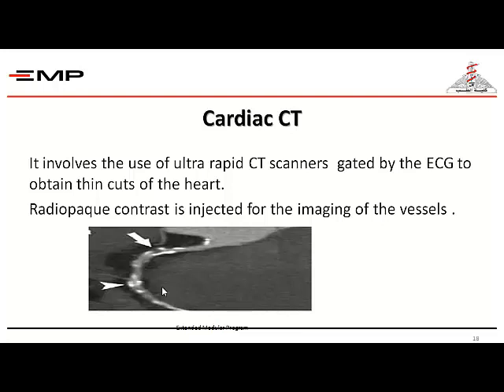You can also get some prognostic information without the use of the dye, in the form of the calcium scoring system, which classifies patients into high risk of having coronary artery stenosis or atherosclerosis by having a high calcium score, or low risk by having a low calcium score.